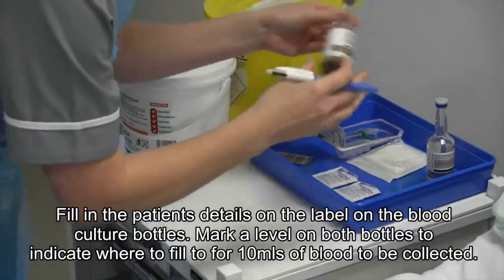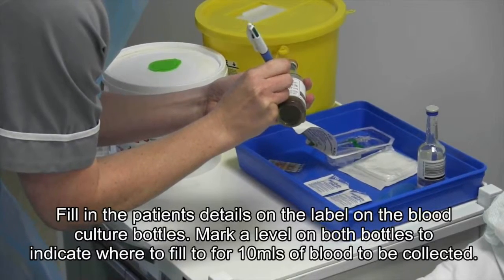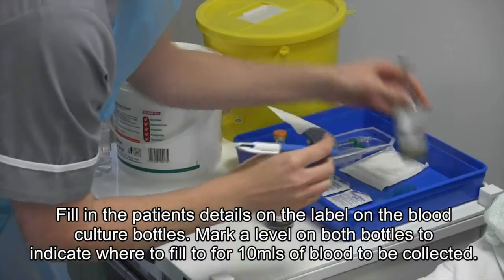Fill in the patient's details on the label on the blood culture bottles. Mark a level on both bottles to indicate where to fill to for 10ml of blood to be collected.